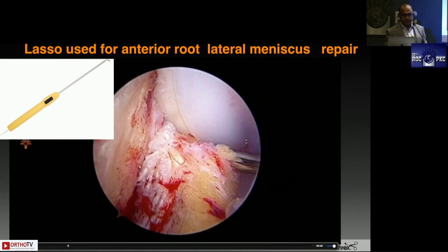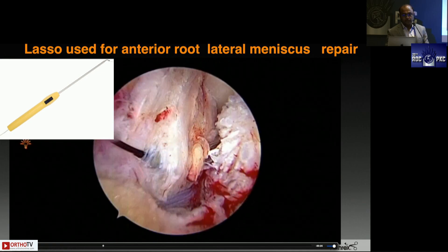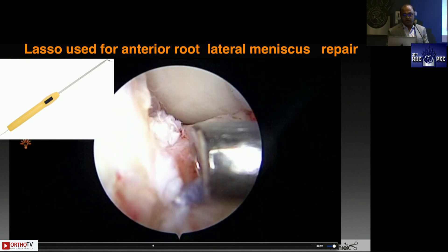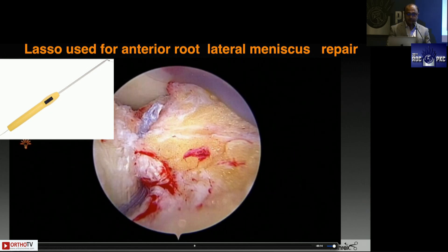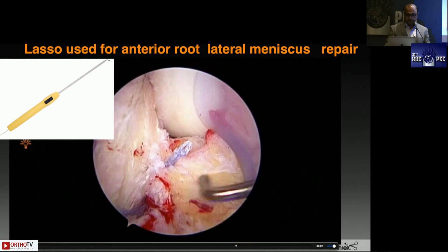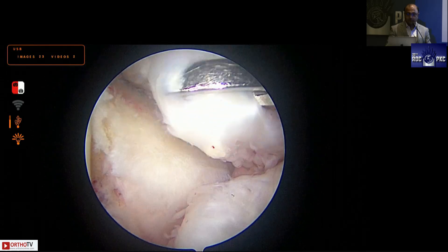This is a lateral meniscus root avulsion or root tear — the ACL graft has been passed and there is a lateral meniscus root tear. This is the left knee, visualization from the anteromedial portal, passport cannula in the anterolateral portal. You come with the lasso, take a bite through the root, and can actually suture it onto the ACL itself if only part of the root is detached, then simply tie a knot. Zero number and two-zero fiber wires are low-profile suture materials available for such repairs.